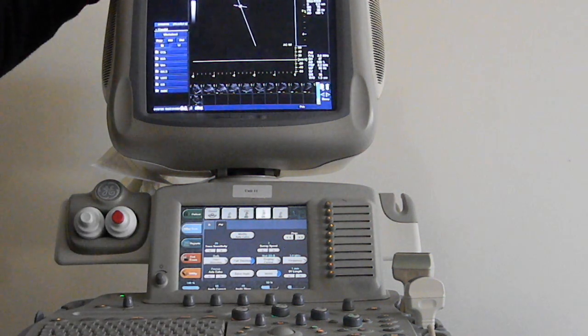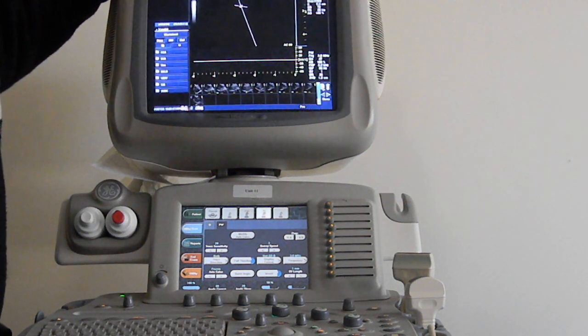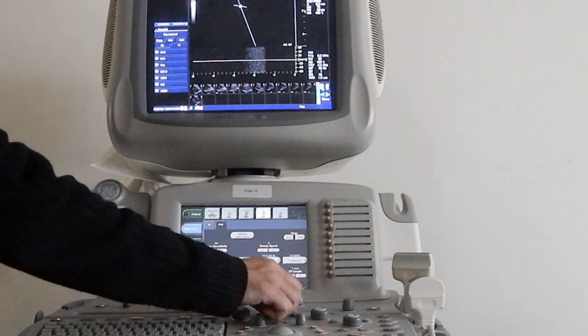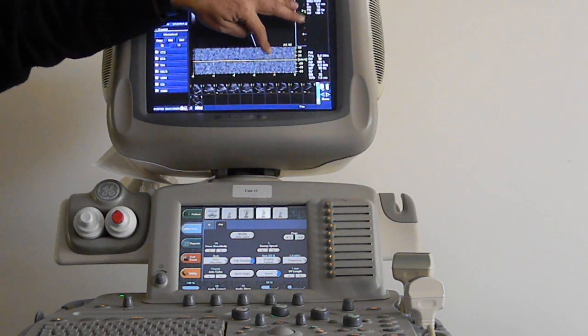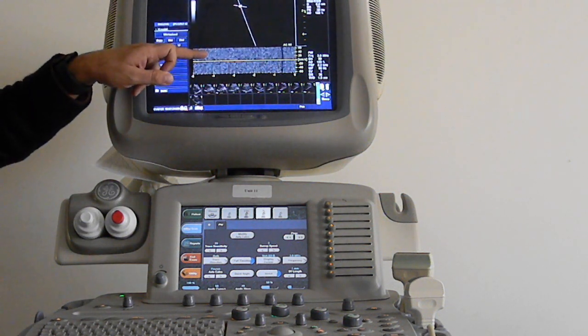This is good enough. You can hardly hear it, and what you may hear is okay as you will be running, in this case, Doppler, or even echo. You will hear a loud sound. You can even increase this here if you need to, and it's going to be audible and visual noise. But this noise here is annoying to hear.